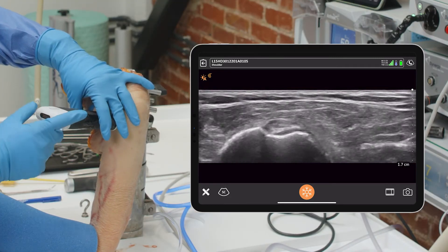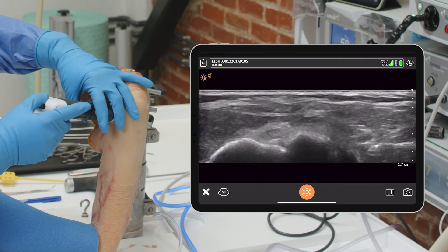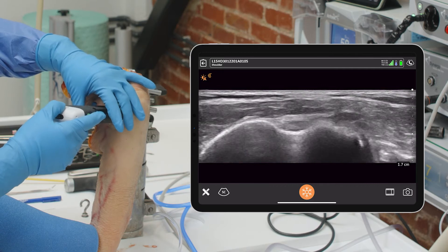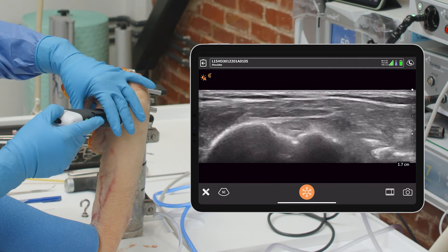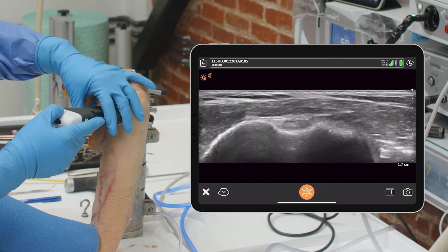I'm going to change the orientation a bit. I move the arm into a little bit of external rotation so I can see better. Coming up — there's the notch, very clearly there. We're going to follow it down, and that's pretty much where we want to be. There's our spot as it exits the notch — notch, no notch. That's going to be our spot right there.